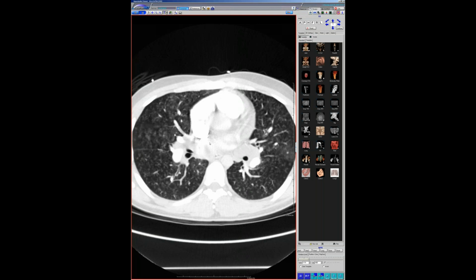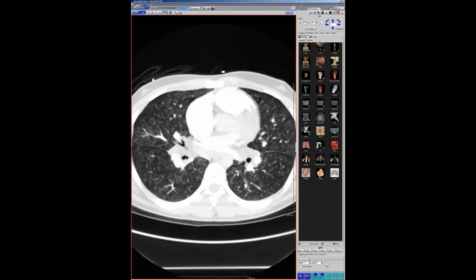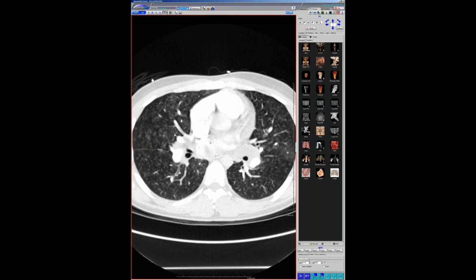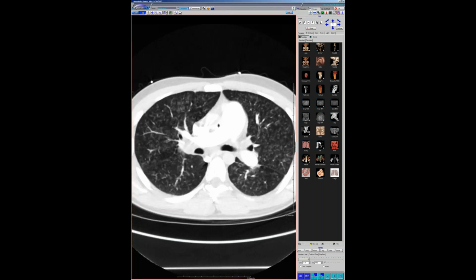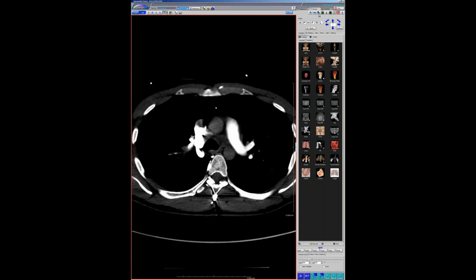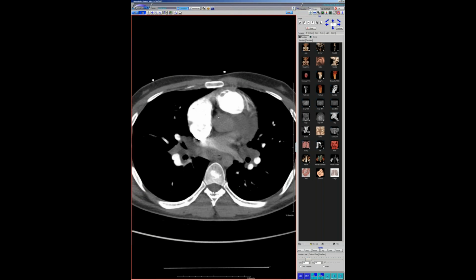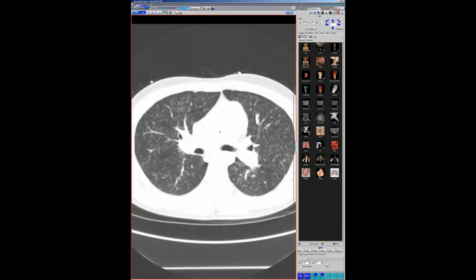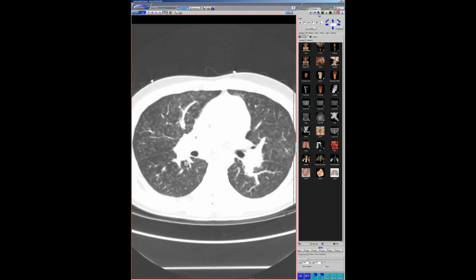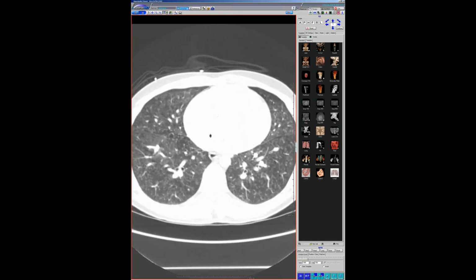And the PVOD ones I see tend to have some pretty big nodes due to the fact that it's basically fluid from impaired drainage, and you get these edematous looking nodes. This one just has really bulky nodes. So we were wondering if it could be sarcoid related, or he just has bulky nodes due to the PCH. So I looked at about 10 cases of PCH we have here, and I haven't seen nodes as big as this, but I don't know what other thoughts you guys have.